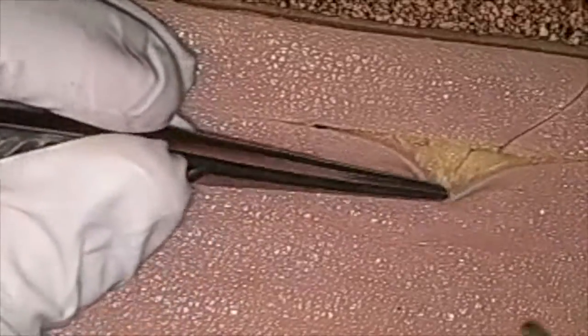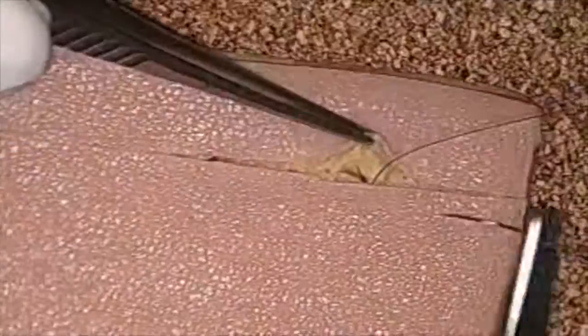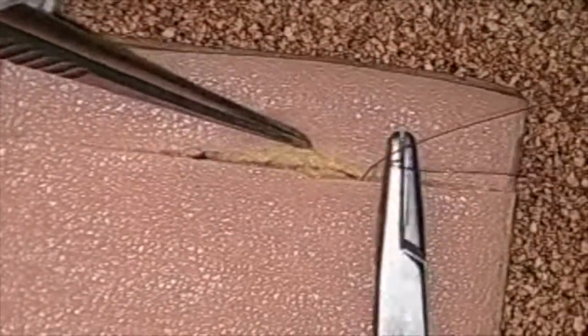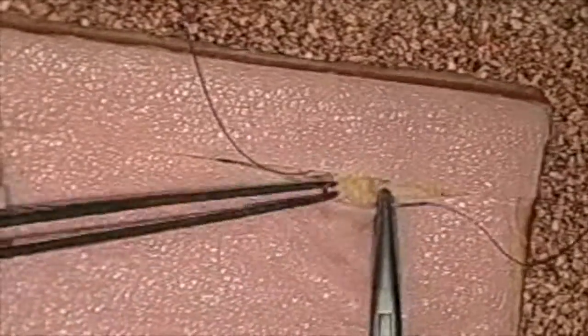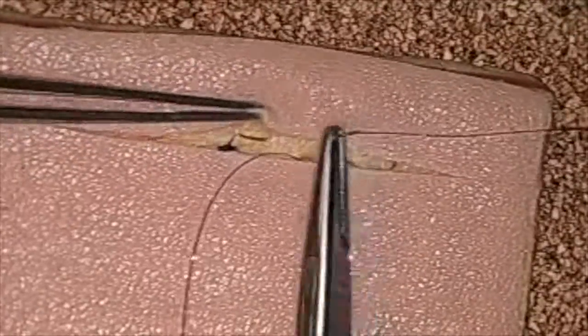Now we're going to go ahead and pretend that this is subcutaneous tissue. It's another deep to superficial, superficial to deep. You can see here that it sits nicely down in the synthetic tissue. Then go ahead and practice your surgeon's knot and start your continuous line. You can see here we're taking horizontal bites — horizontal in relation to the horizon — not vertical like those linea bites. We typically do these for subcutaneous and subcuticular patterns.